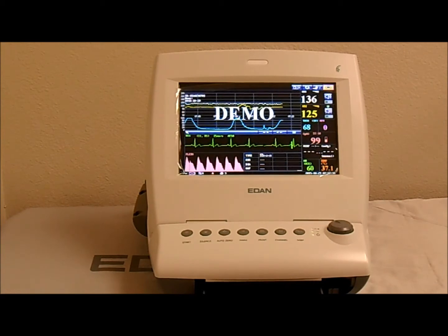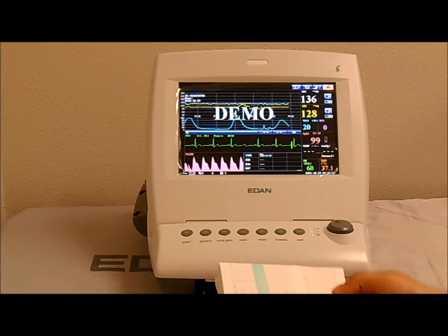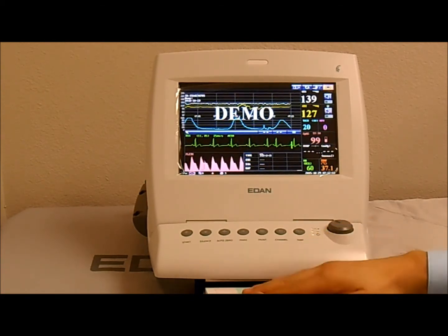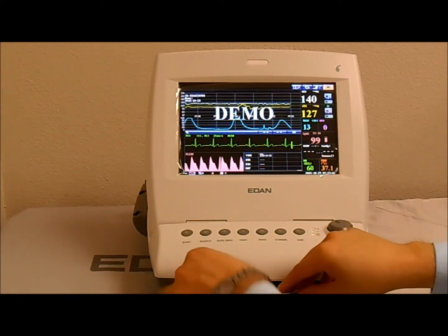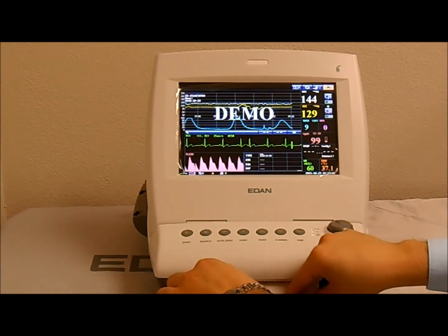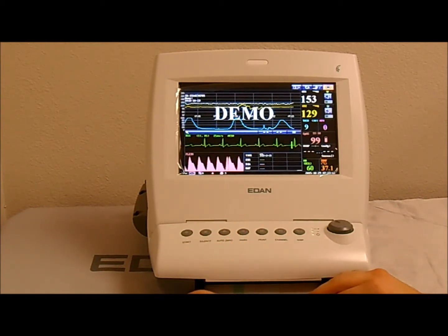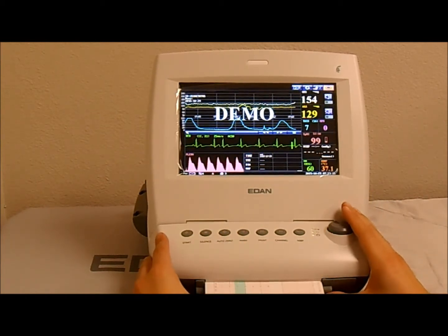So when you place the paper, the FHR reference has to be on the left side. The CTG or the TOCO has to be on the right. So on the left, the grid should be going from 30 to 240, and on the right, it's 0 to 100. So you load the paper with the grid facing up. You want to make sure it's nice and centered. And then you take one sheet and prop it over the roller, and now you can close the compartment.